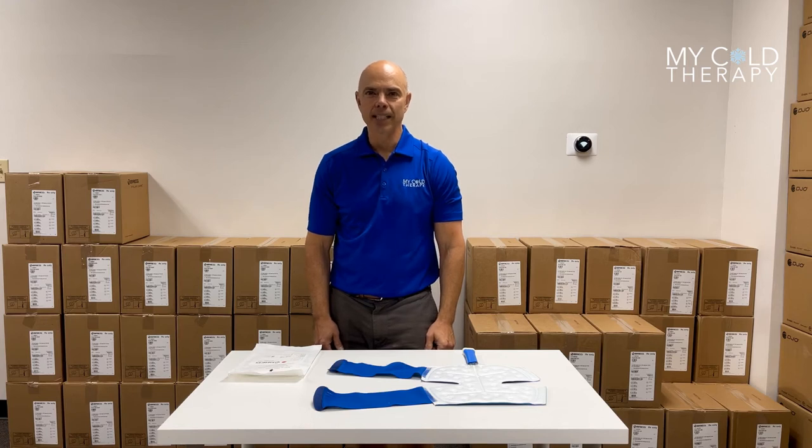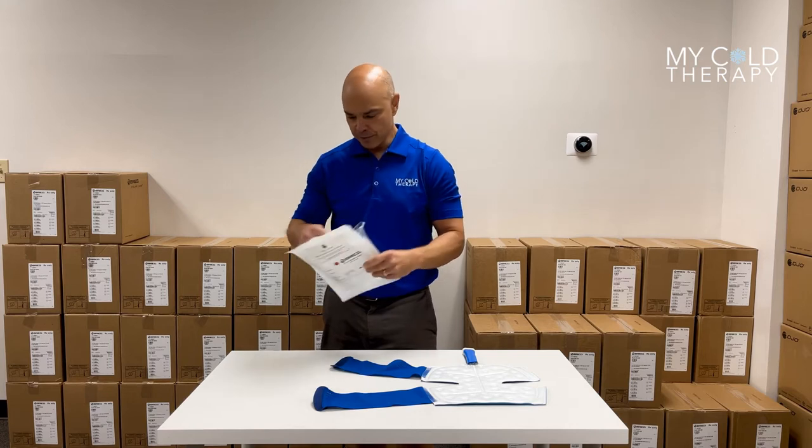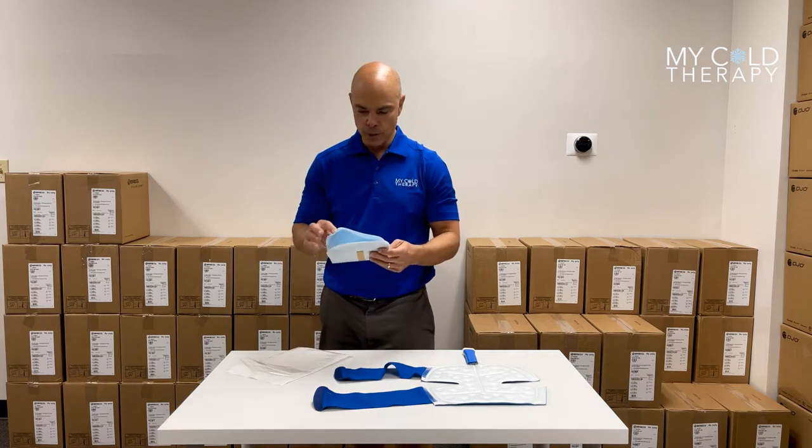Hi, my name is Steve from My Cold Therapy, and today we're going to talk about the Bregg Polacare Cube Sterile Pads. This is what it's going to look like when you get it in the mail. You take the back off, and this is what the sterile pad will look like.